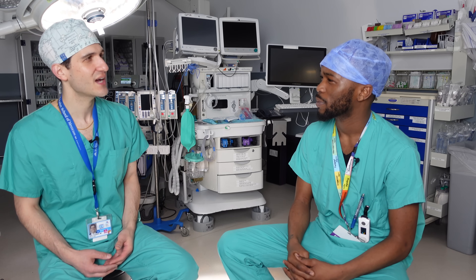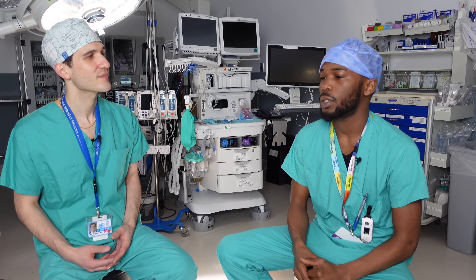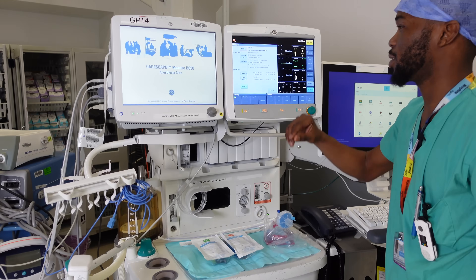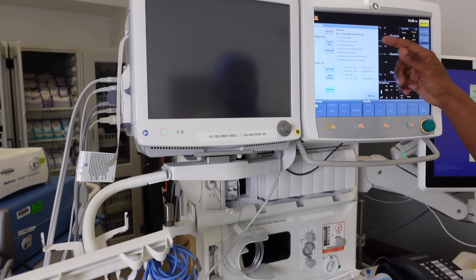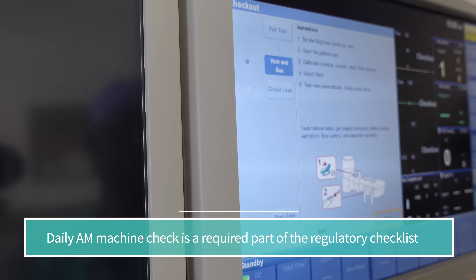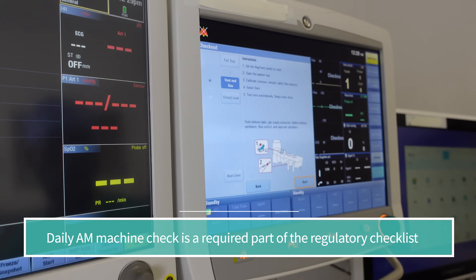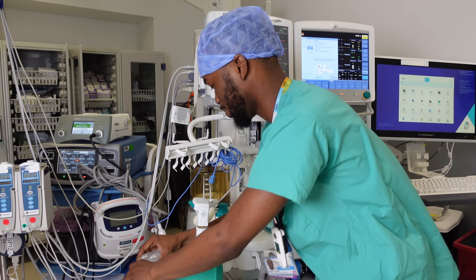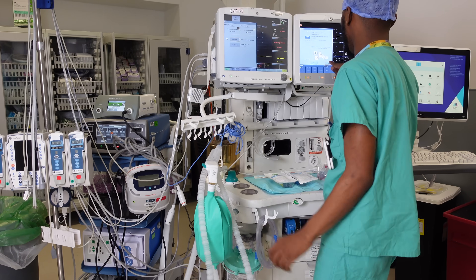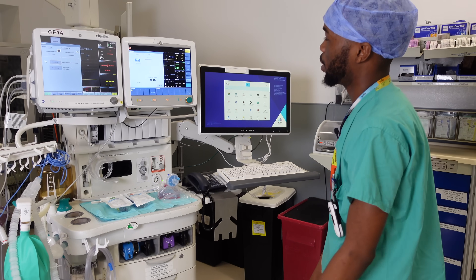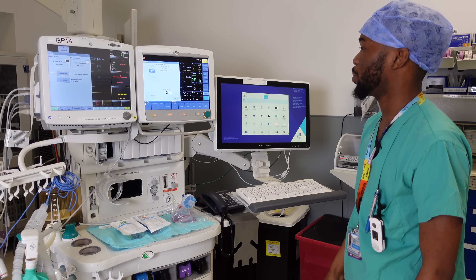Tell me about a machine checkout — what's the importance of that? It's very important because the machine checkout checks for any leaks and avoids any problems the machine might have had while it was off, so you can see the problem before it even begins. You hit full test and it's basically self-explanatory — it tells you on screen what to do. It tells you to switch, you hit the switch, you make sure everything is out, then you hit the button. Right now it's analyzing the machine, making sure everything is connected, and it's going well.